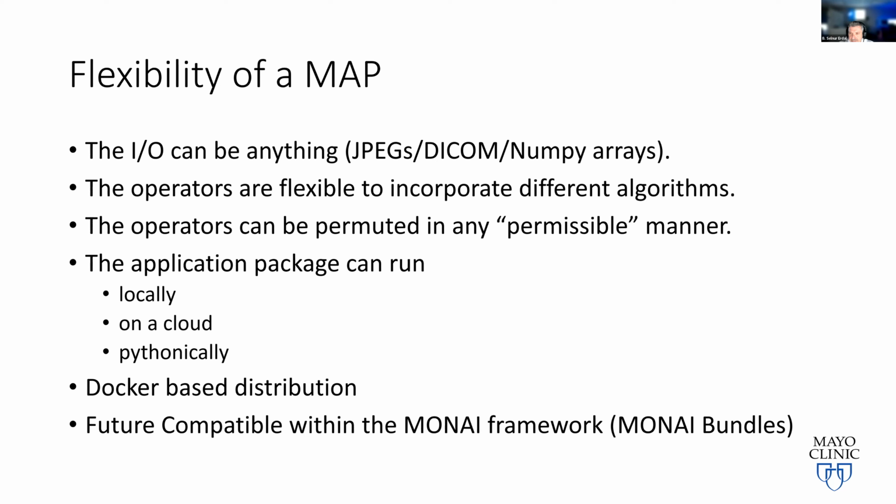What we call bundles is like, if you're using an algorithm to train AI, once it comes to deployment, you want your packages to be able to sync with each other. This is already part of the package as well.